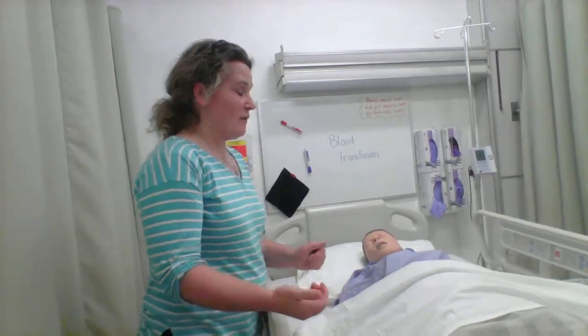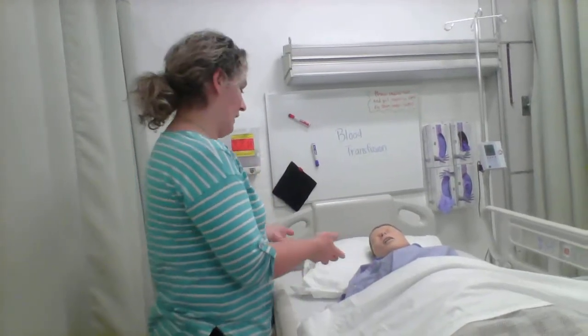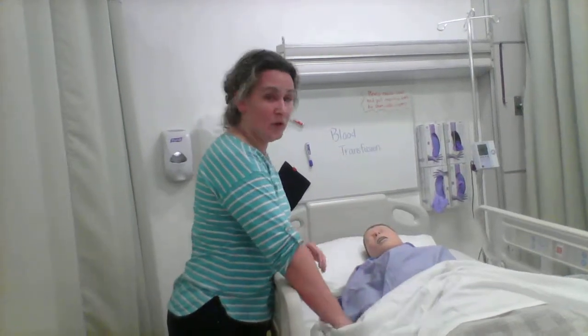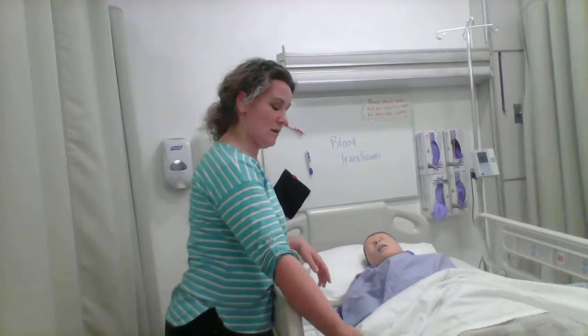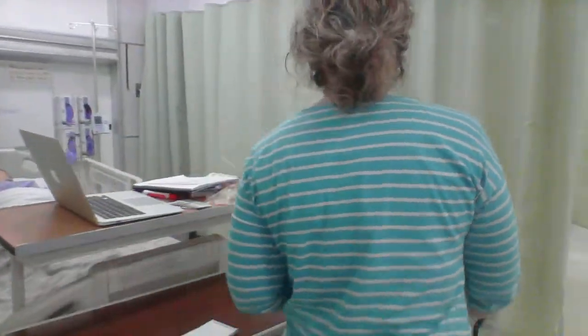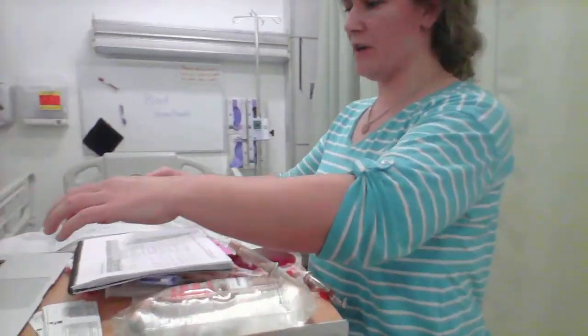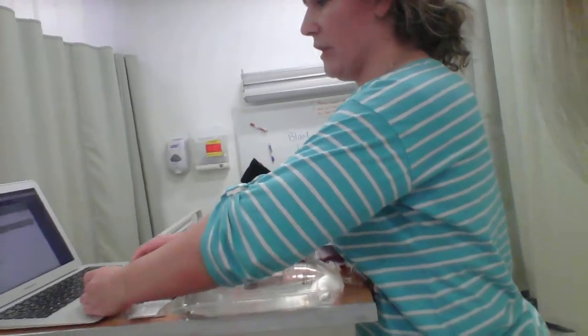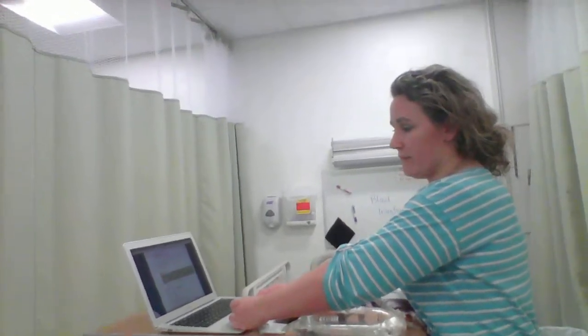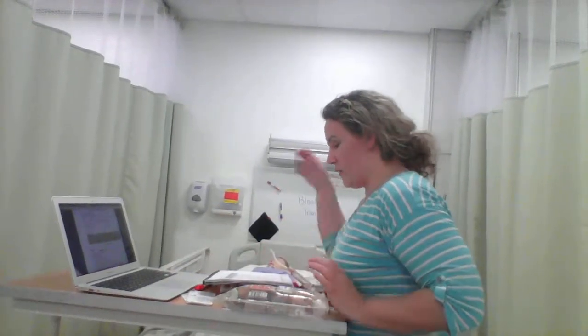Okay. So before we start, I'm going to go ahead and do the blood pressure, the temperature, the pulse and the respiration and the O2 saturation. And then once I do that set of vitals, I'm going to come over here and document in his blood administration record the before transfusion vitals: temperature, pulse, and blood pressure. So we went ahead and did that.